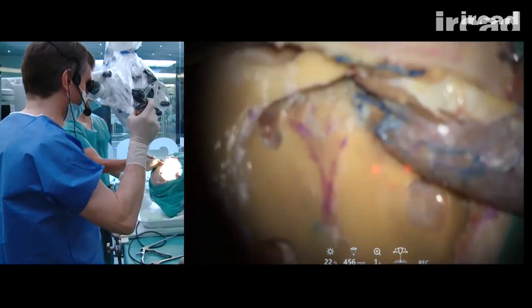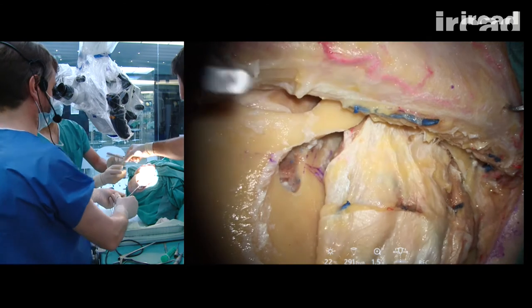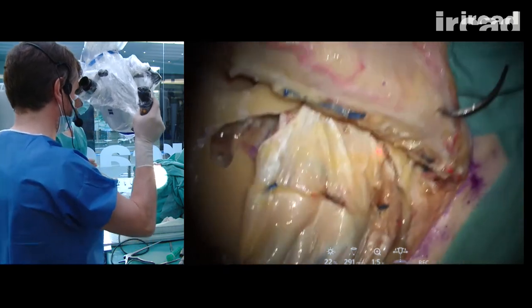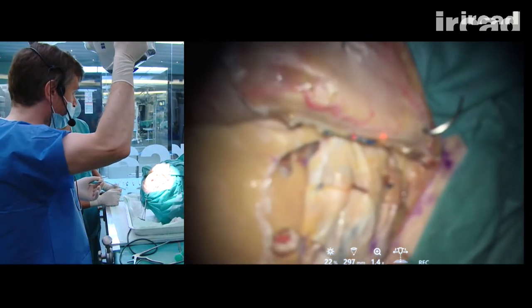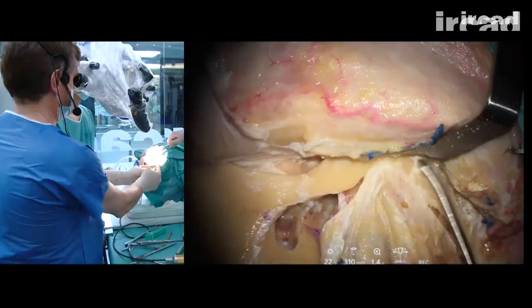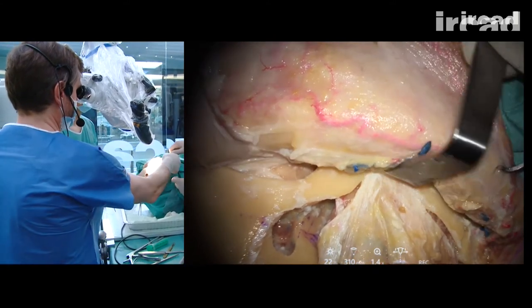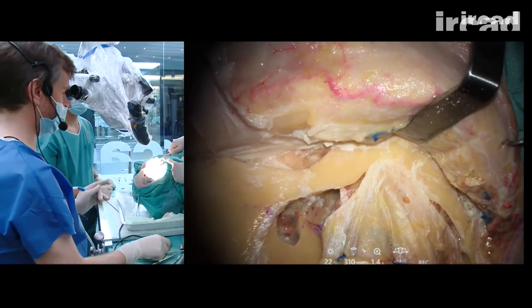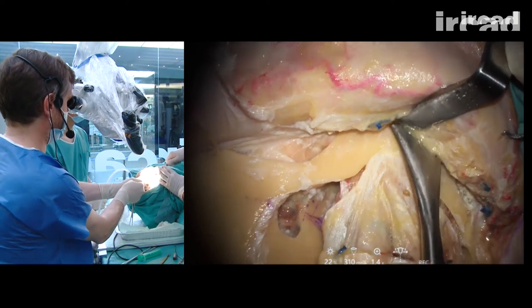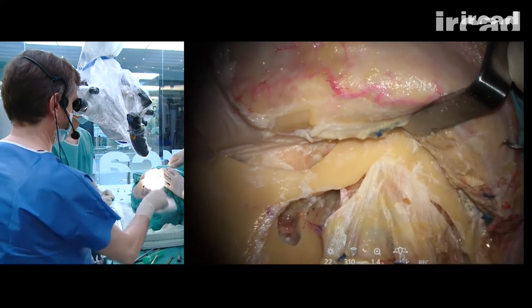Now, l'enlever, Fumi. We will do the cut over the body of the zygoma. It's a difficult cut because you need a significant amount of retraction. And if your incision at the beginning does not consider this retraction, then it can be very difficult to expose this part of the maxilla. And you need to expose it if you want to cut it.